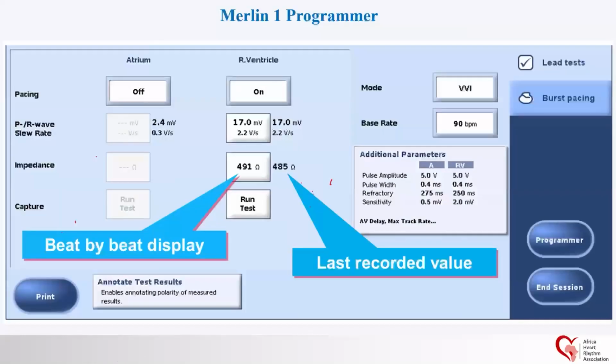Can I just add one point about the question he asked? So the ST segment, we call it current of injury, which is like we are creating an MI for that tissue. That means you are deep in this tissue and you have good fixation, so you will not expect any dislodgement in the future.